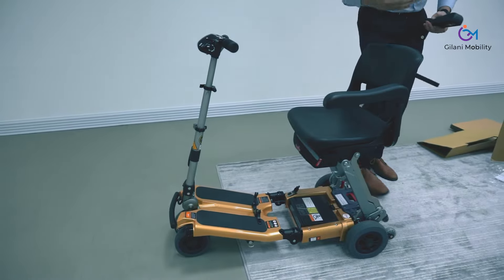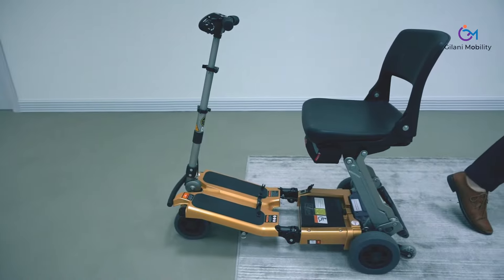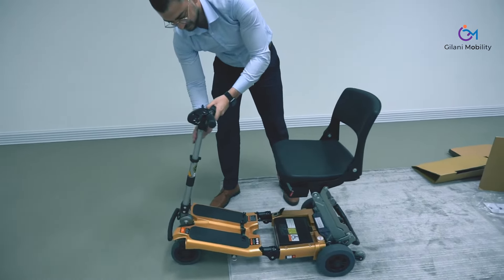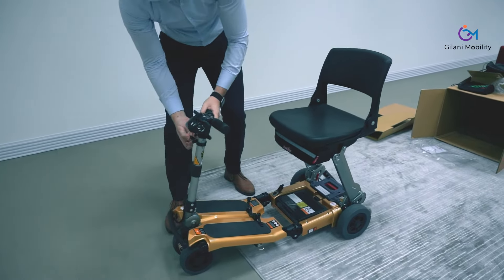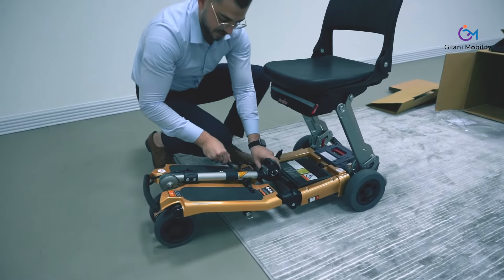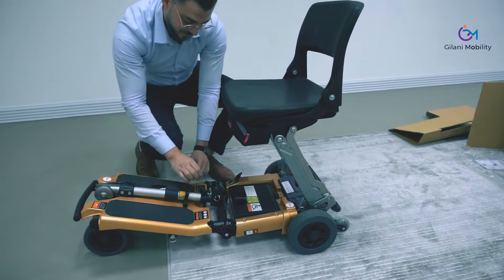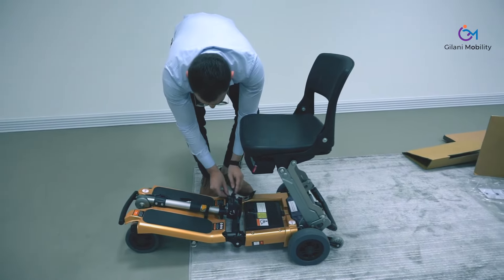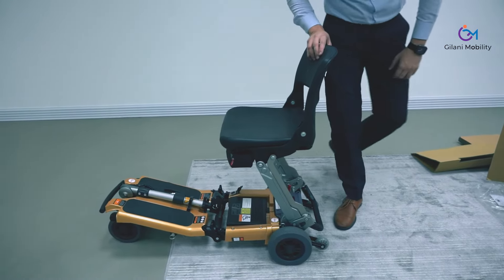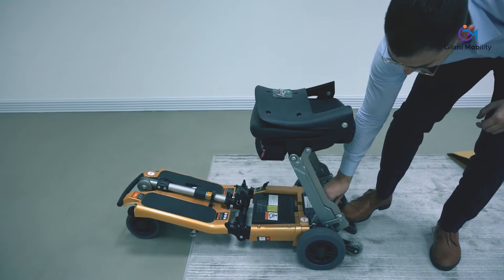Whenever you want to remove the armrests, as you saw, just slide them straight out — they come out from the frame underneath the seat. The double telescopic handlebar allows for a great extra range of adjustment, and with the flip of a lever it can be folded back down. When traveling, the handlebar location keeps it 100% safe — even if at the airport or a taxi driver is a bit rough with your scooter, you don't need to worry about anything breaking. Trust that your equipment is safe.